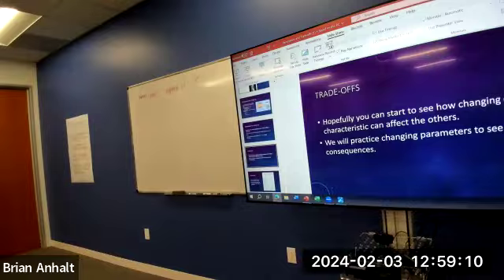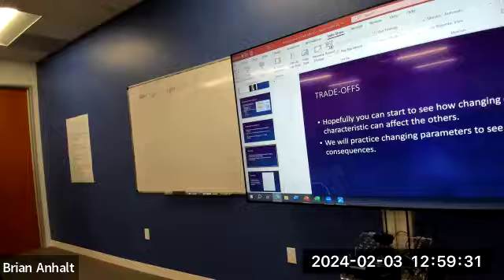So there's gonna be questions like this. I'm gonna give you scenarios. I'm scanning a patient's brain and the images look fuzzy. Which one of the following changes will help me alleviate the issue? If it looks fuzzy, what's the problem? Noise. Hmm? Low resolution. There we go.